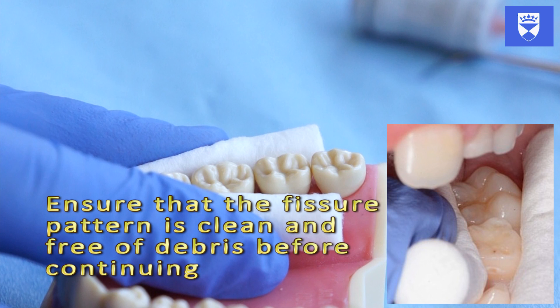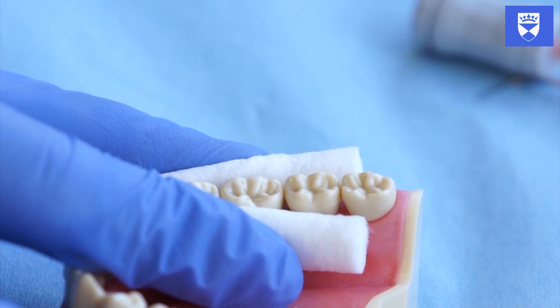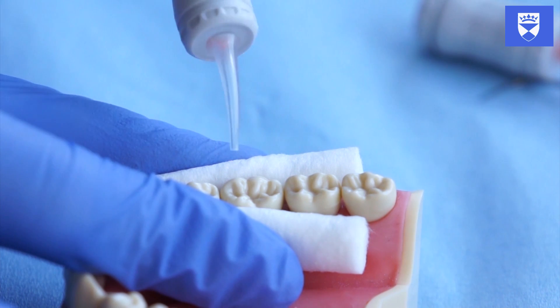The tooth should once more be dried. When you are happy that the tooth surface is suitable for a glass ionomer sealant, it is time to place it. There are two alternative techniques for the first stages of placing a glass ionomer fissure sealant.